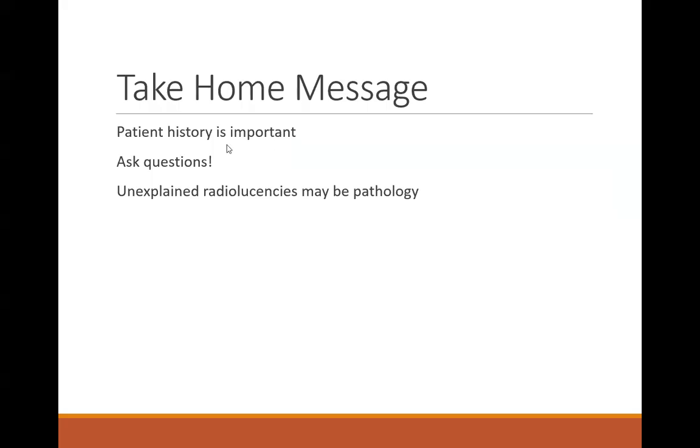A lot of times it's important to take a good dental history and ask questions, because sometimes there can be radiolucencies that may be pathology but may not be, and something might have been there for a long time. Sometimes the patient will know and sometimes they won't. So you want to make sure you find out if what you're looking at can be documented in past radiographs or if it's new, and document what you see for the future oral health providers, dental hygienists, and dentists who see that patient. All right, that's it for that one.